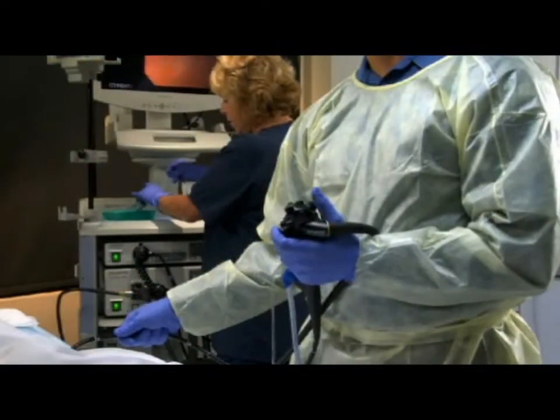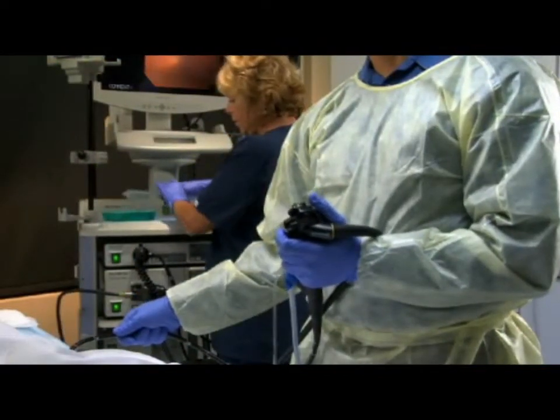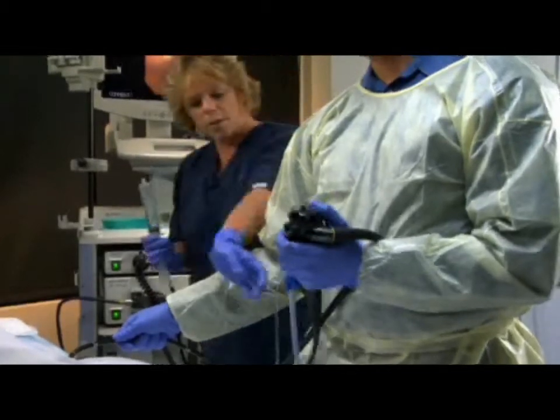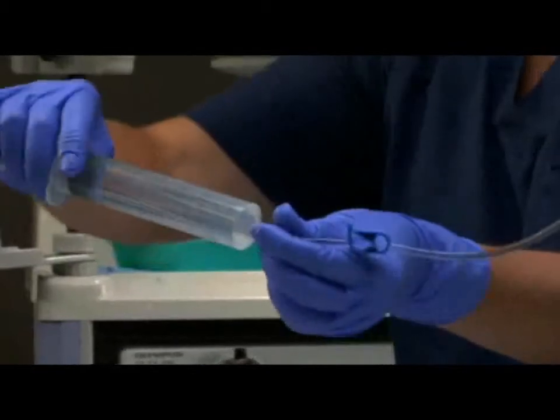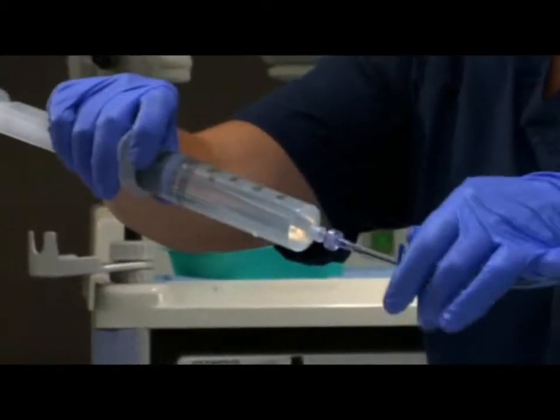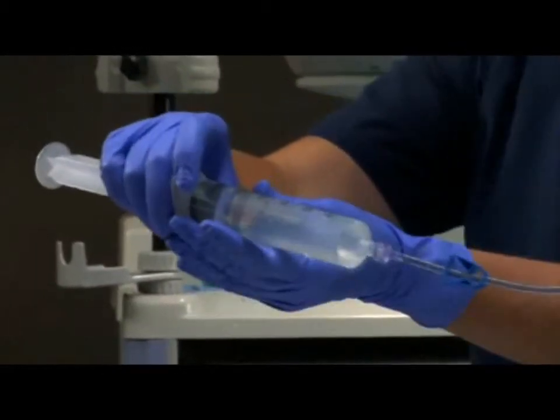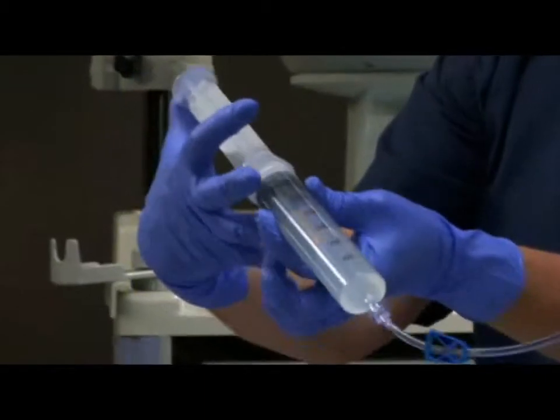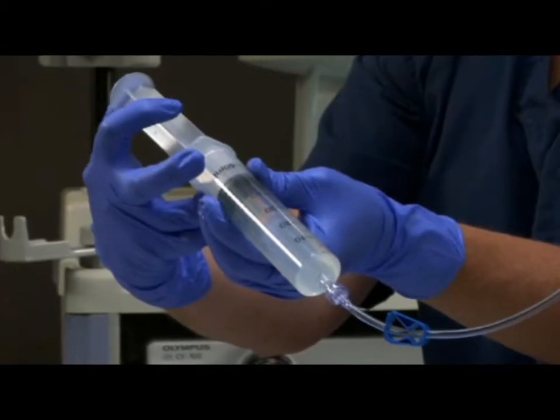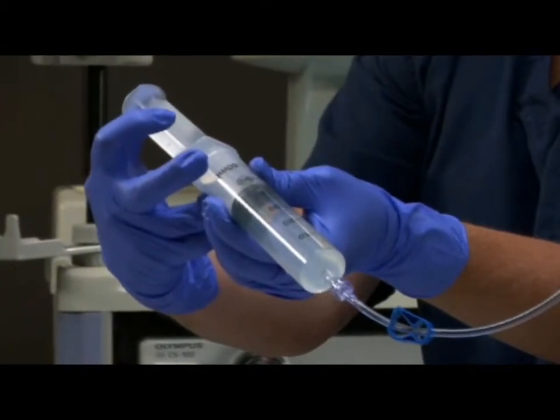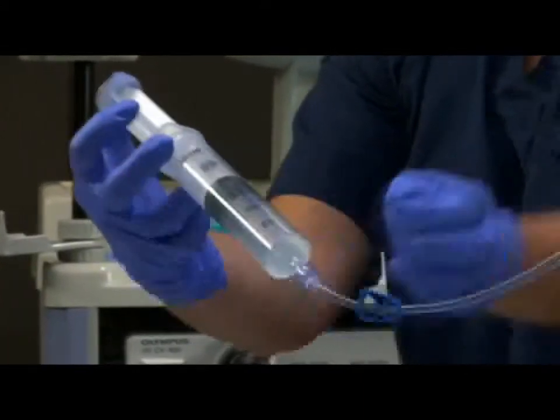When using a syringe for irrigation, the nurse will first prepare the syringe. Next, connect the syringe to the BioVac device's irrigation line. Open the blue pinch clamp on the BioVac device's irrigation line and use the syringe as necessary to irrigate. Close the blue pinch clamp on the irrigation line after irrigation is completed.